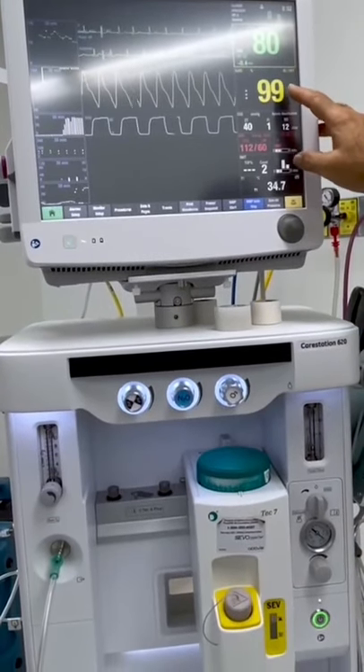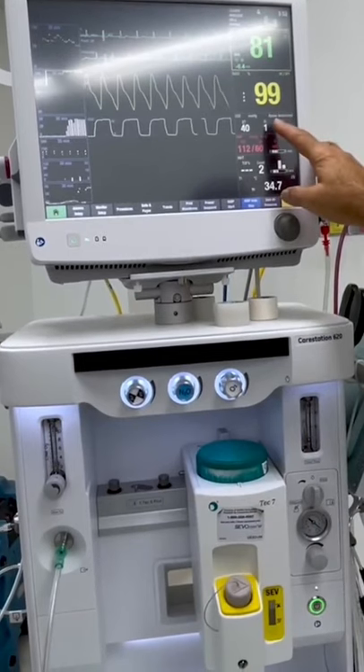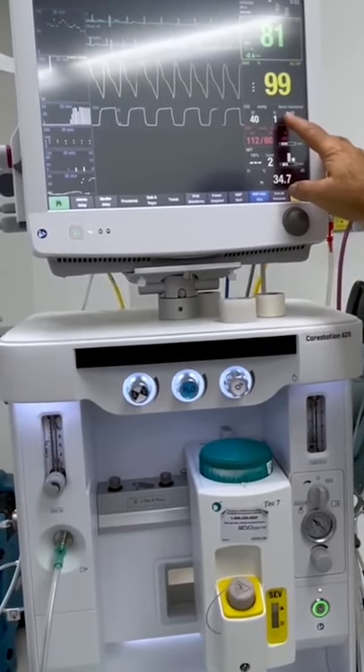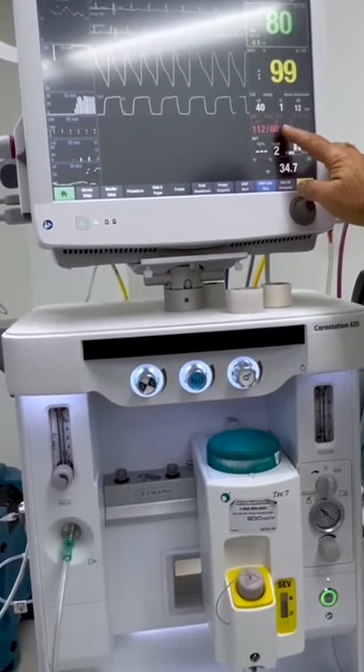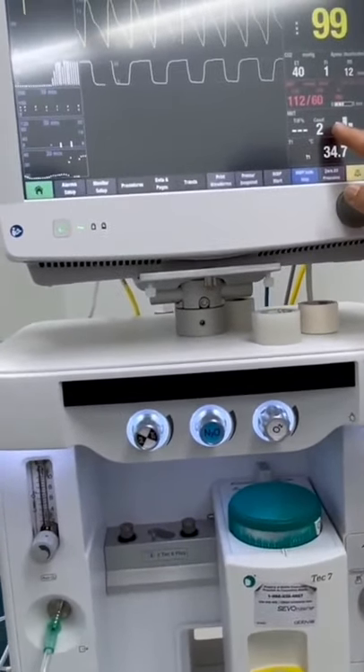This is the patient's vital signs monitor, so this tells you the heart rate, which is stable, the oxygen saturation, which is excellent. This is the carbon dioxide the patient is breathing out. Here's the blood pressure of the patient, which is normal.